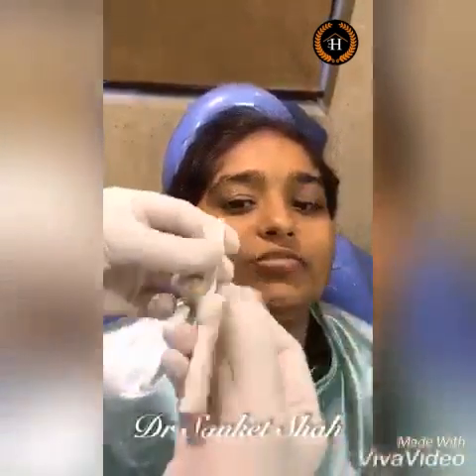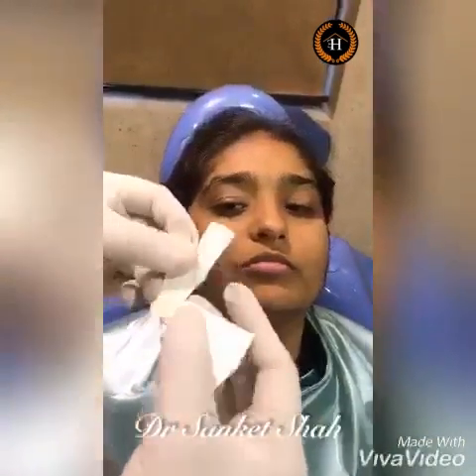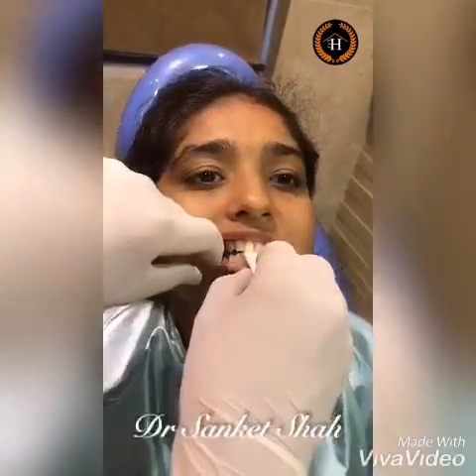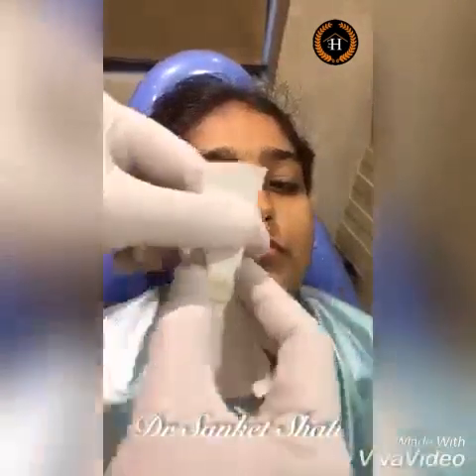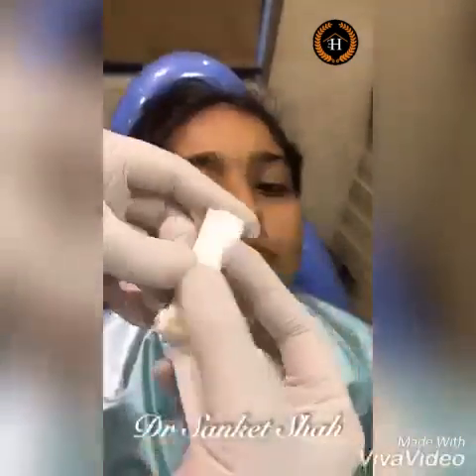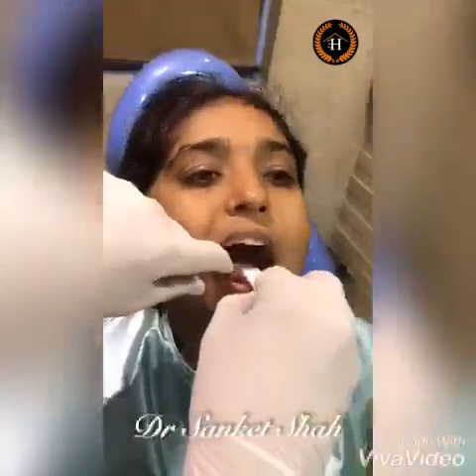I still increase the number of leaves — let's say by three or four more. I again place it in the incisal area. Bite from behind, forward, backward, squeeze. Are the teeth still touching? Yes, still the same teeth are touching. Open. I still increase the number of leaves by approximately six more.